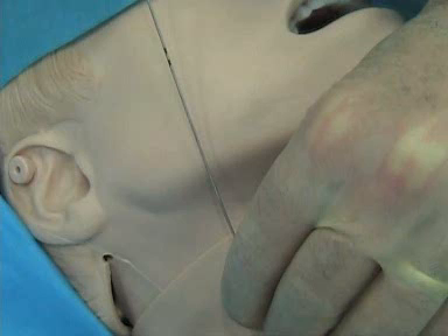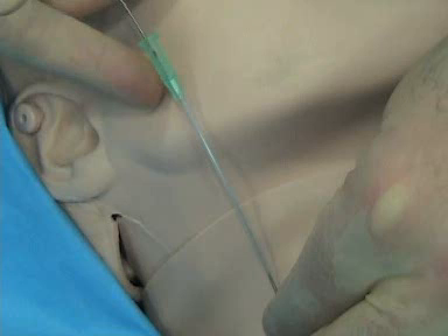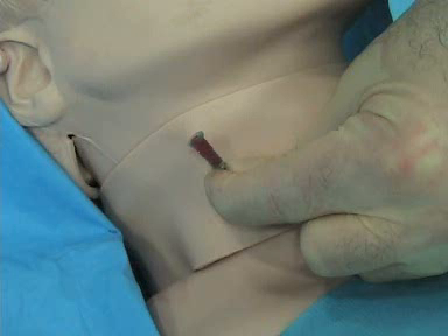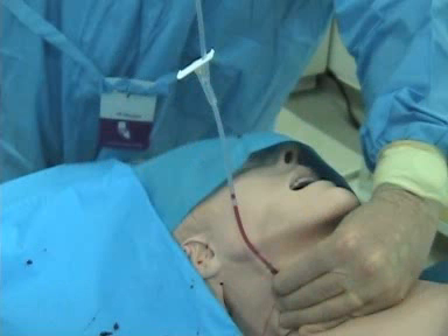Once that wire is all the way in, you might say you're in the right place — wrong. What you want to do is prove to yourself that you are in the right place. I have an 18-gauge catheter with a green hub. I'm going to slide it over the wire, take the wire back out, and see what kind of blood flow I get. I hook up a little bit of extension tubing and hold it up in the air. The blood is only coming up a few centimeters, which corresponds to a CVP of 0, 5, or 6 — it certainly would not correspond to an arterial pressure of 120 over 80, in which case the blood would go all the way up the tubing and out the top. So I've taken a minute to make sure that wire is in the correct place.